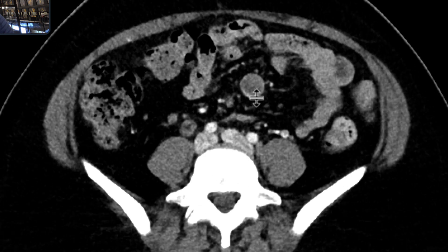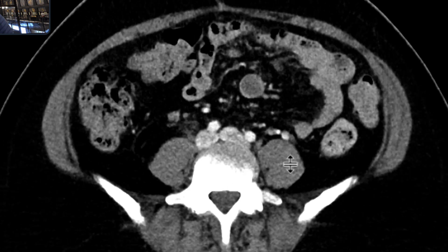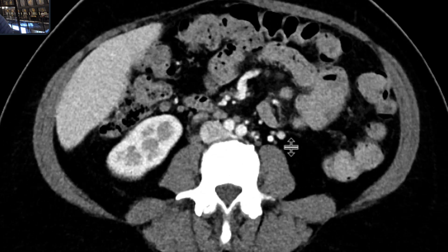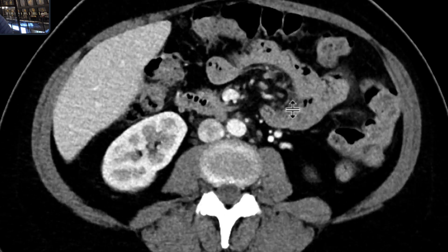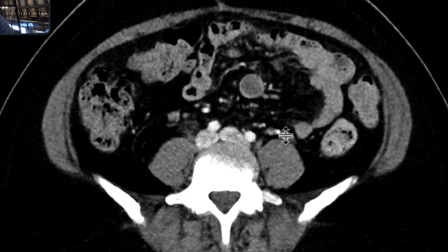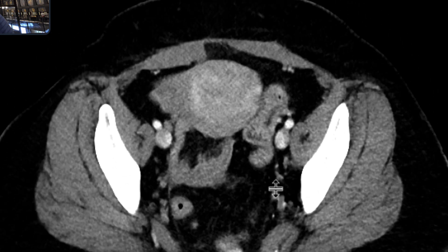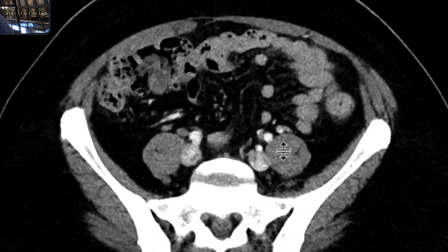In addition, we can see that there's this unusual mesenteric node that's larger than it should be, and a few other mesenteric nodes that are also unusual — a little bit bigger than they should be and a little bit more heterogeneous.